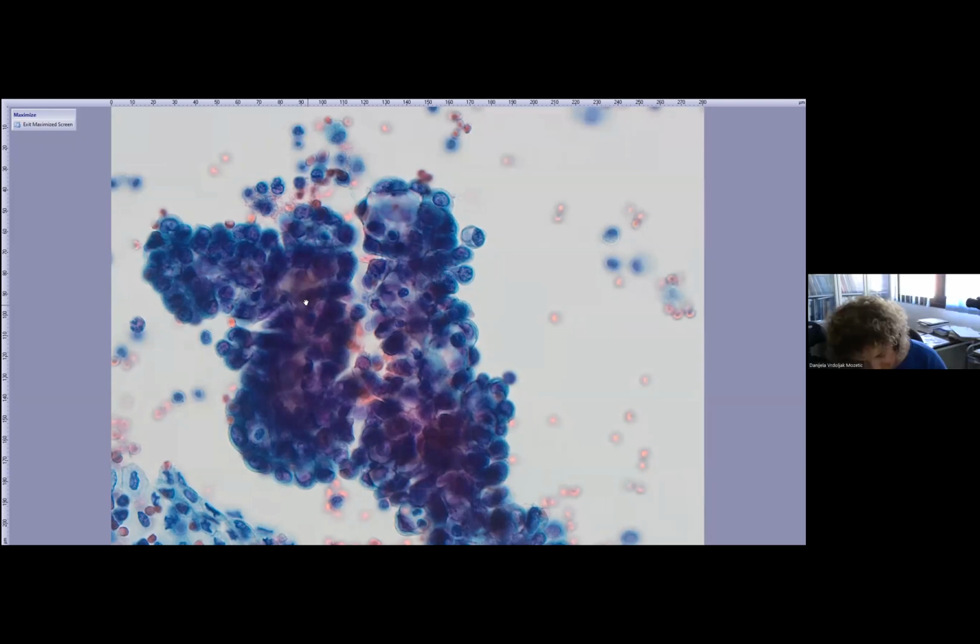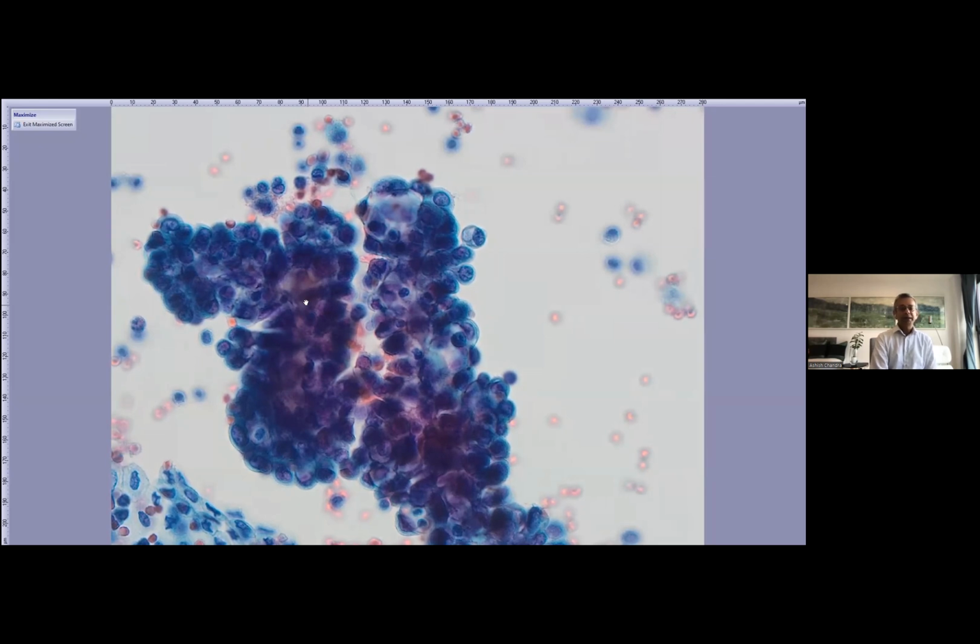And of course, morphologically, the helpful feature, if you see the psammoma bodies, then, again, to call it atypia would be fine. Because you haven't got the high grade morphology, I think you should use the suspicious category, Sarah, if you see high nuclear grade morphology. But of course, you would then suggest doing the immunopanel, which would include P53.